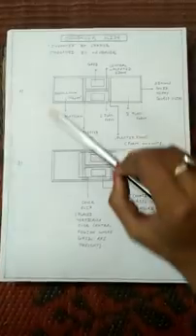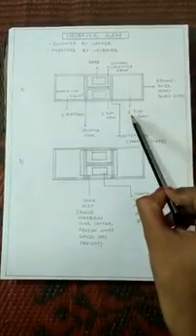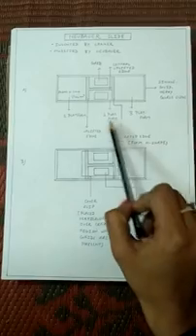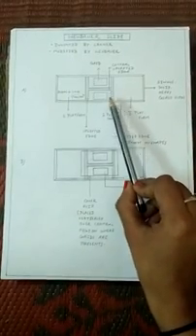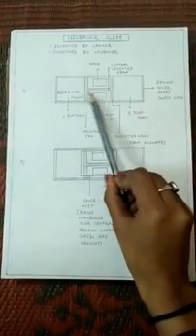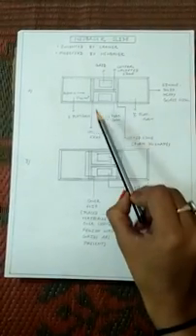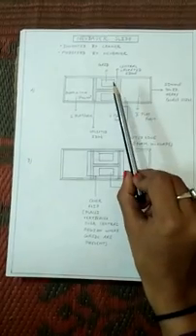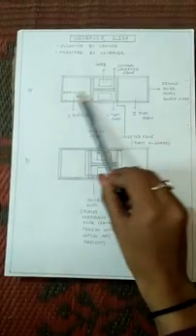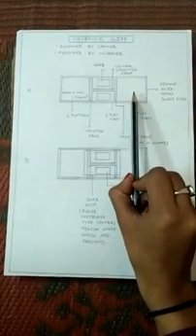human blood. So friends, you can also see some platforms in this slide. This is the first platform, this is the second platform, this is the third platform. Friends, the first and second platforms are separated by this uplifted edge, and the second and third platforms are also separated with the help of this uplifted edge. So this uplifted edge forms an H shape. You can see this is a central uplifted edge, and due to this central uplifted edge, the second platform is further divided into two columns. So friends, due to these uplifted edges, this whole slide was divided into three columns: first platform, second platform and third platform.